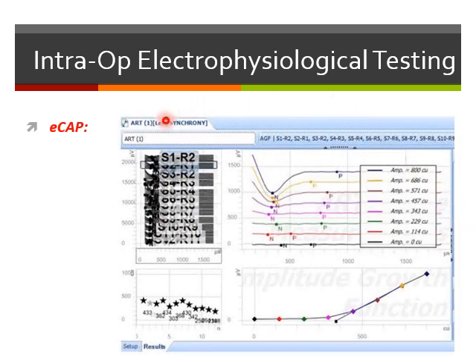Here is an example also of the interface or the panel of the measuring software. As we can see here, as the electric current increases, there is N1 P1, N1 P1. As the current increases, the distance between N and P increases because the amplitude increases. The relation between the stimulating current and the amplitude is normally a linear relation like that.